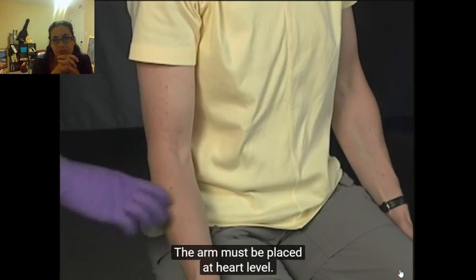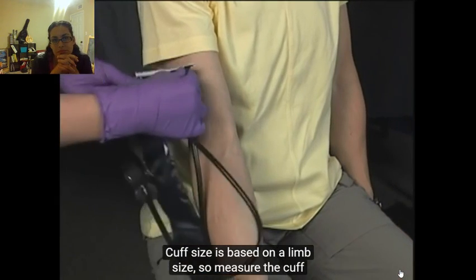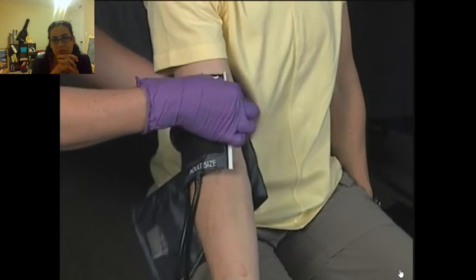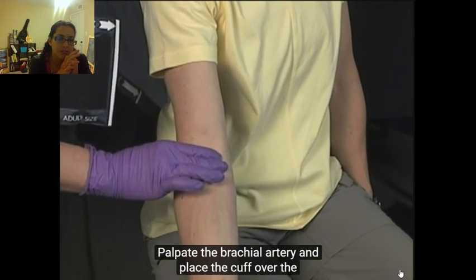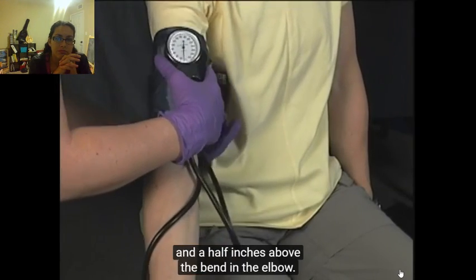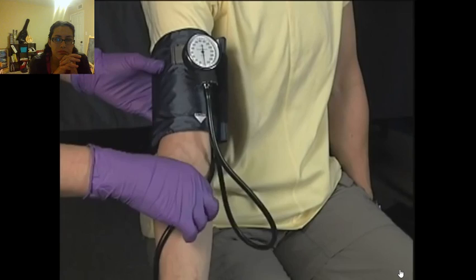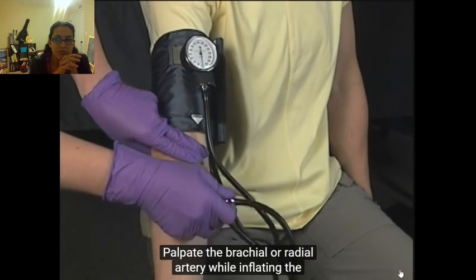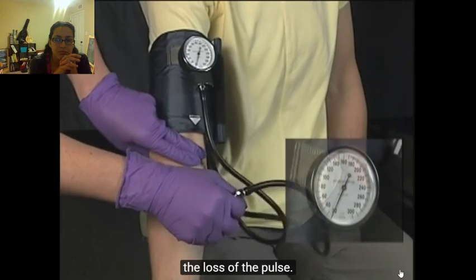The arm must be placed at heart level. Cuff size is based on limb size, so measure the cuff appropriately. Palpate the brachial artery and place the cuff over the brachial artery, keeping the bottom of the cuff 1 to 1.5 inches above the bend in the elbow. Palpate the brachial or radial artery while inflating the cuff to 30 millimeters of mercury above the loss of the pulse.